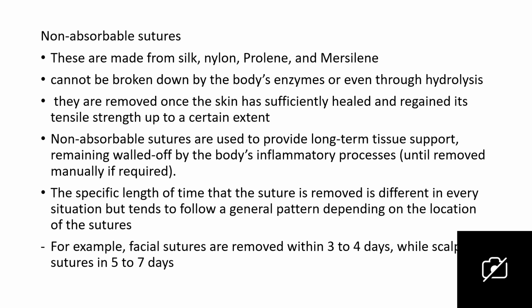The specific length of time before the suture is removed is different in every situation, but tends to follow a general pattern depending on the location of the sutures. For example, facial sutures are removed within 3 to 4 days, while scalp and skin tissue sutures are removed in 5 to 7 days. Usually, we take about 5 to 7 days. We keep it there longer, so okay.